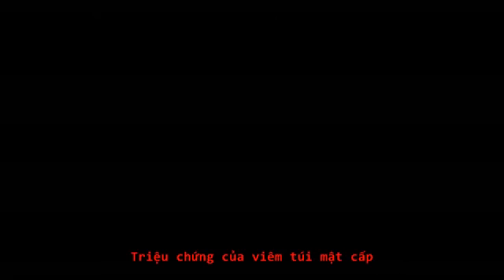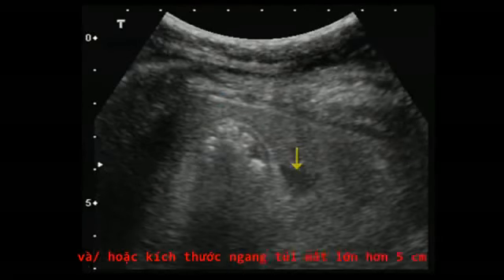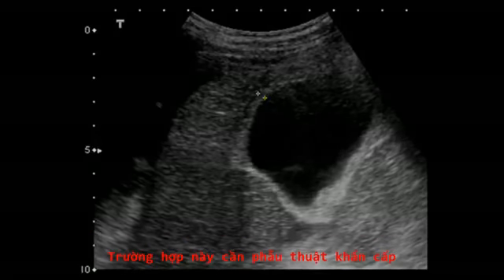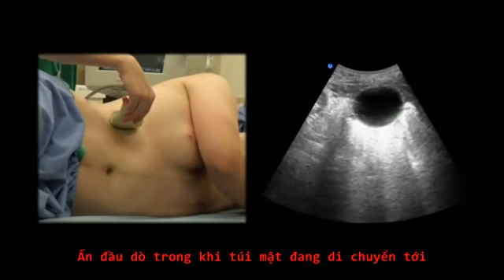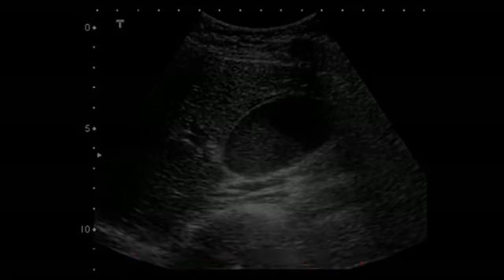The findings in cholecystitis include thickened anterior wall greater than 4 mm, pericholecystic fluid, and/or a transverse diameter greater than 5 cm. Some bacteria will cause an emphysematous wall, necessitating immediate surgical intervention. Pushing on the probe while the gallbladder is centered in view may elicit an exacerbation of the patient's pain. This is known as a sonographic Murphy's sign. Finding sludge in the gallbladder is common, although nonspecific.